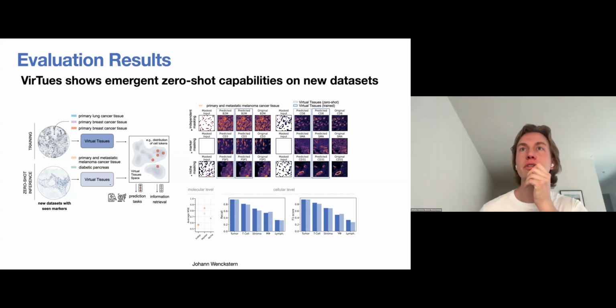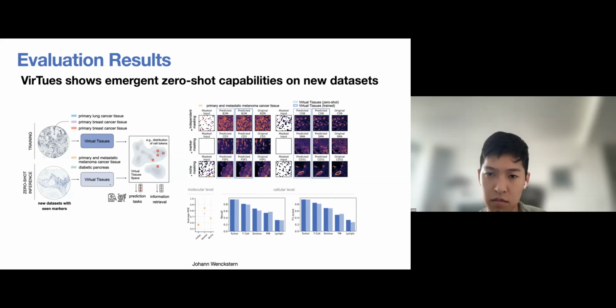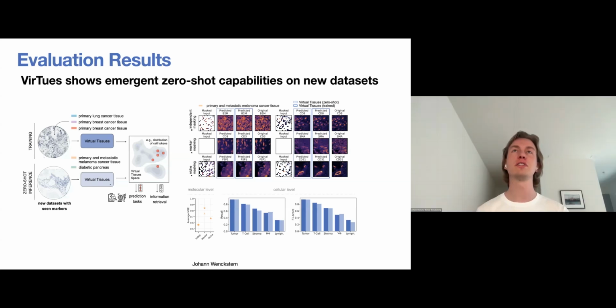I think my general intuition is that in the niche setting, the model cannot really base its reconstructions on correlation between markers in the first place. So it reduces basically to only a pattern matching algorithm or pattern correlation learner. And since these patterns might look quite similar in the new channel, it makes sense that it doesn't drop so much.